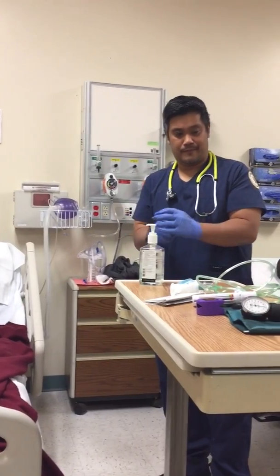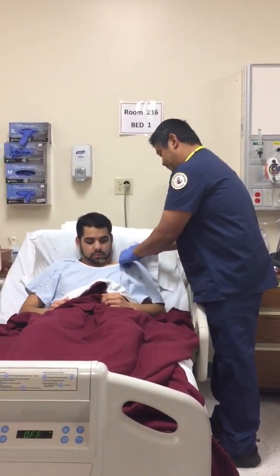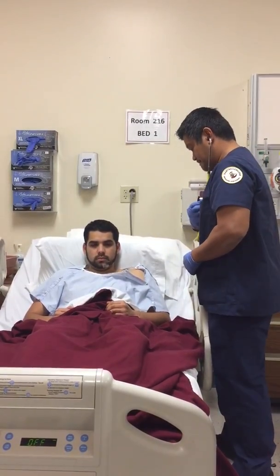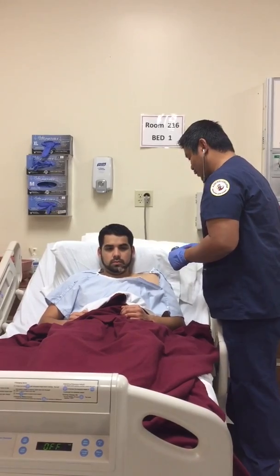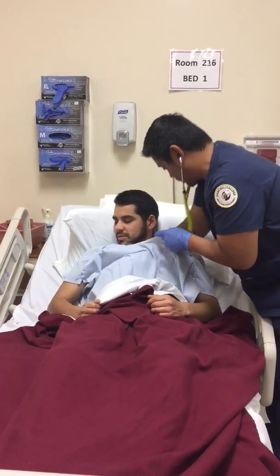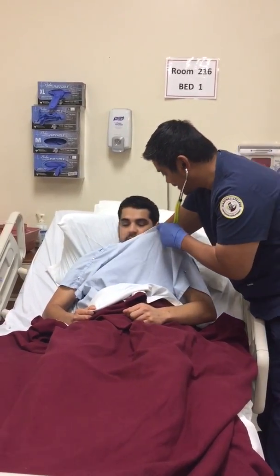All right. So, if you don't mind, we're going to start to listen to your lungs. Would you mind if I just open your gown a little bit to the side? Sure. Just roll this up a little bit. Whenever you feel the stethoscope, just go ahead and take a deep breath in for me, okay? All right, thank you, Christian. It's a little cold. I'm sorry, let me warm that up for you. All right, let's try that again for you. Thank you.